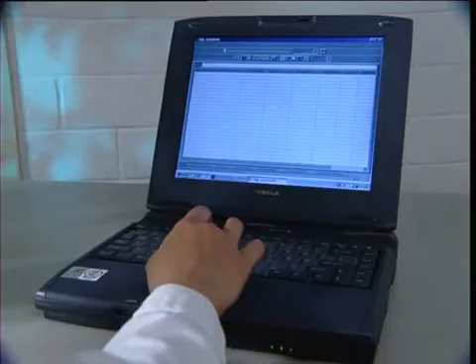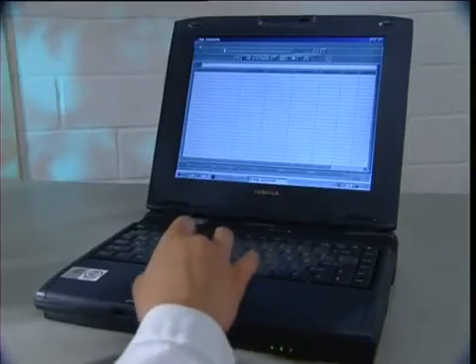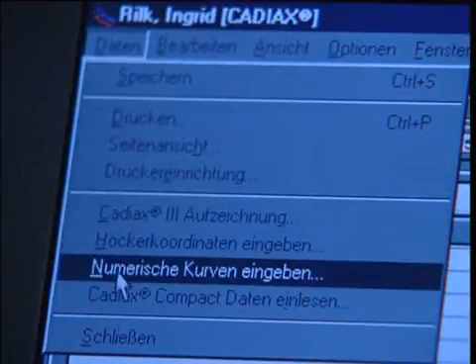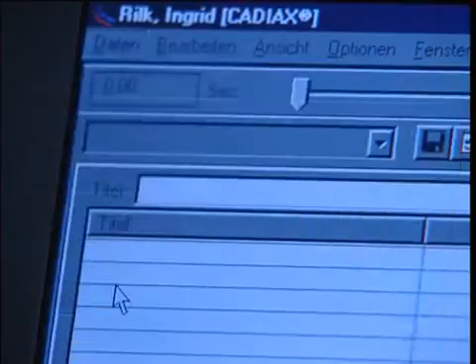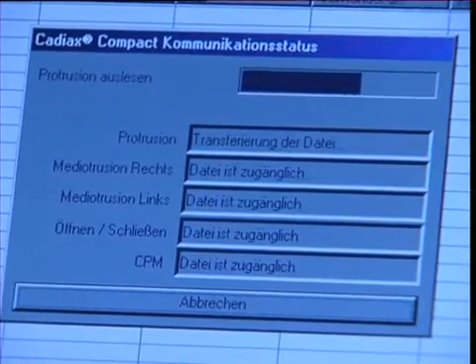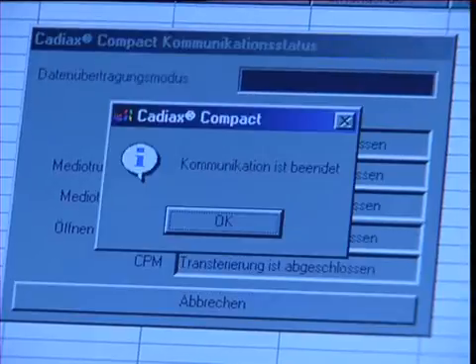Double-clicking any spot in the table activates the Data menu item, which opens the CADIAX Compact Data Input option to initiate communication between the electronic box and the PC. The data transfer process is displayed on the monitor. Click OK to confirm that the data have been transferred completely.